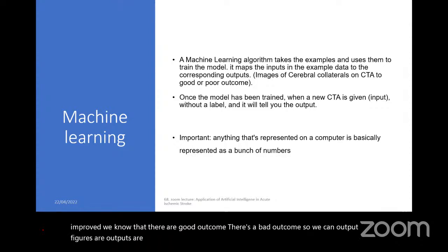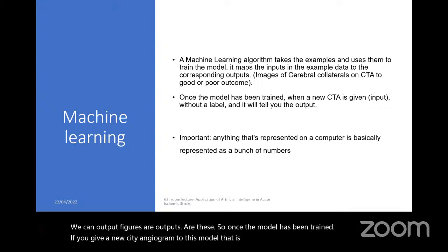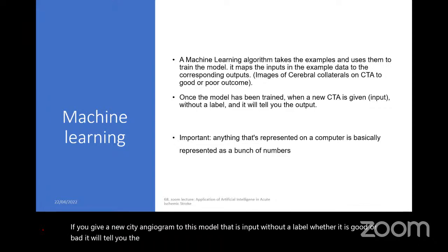Once the model has been trained, if you give a new CT angiogram to this model as input, without a label of whether it is good or bad, it will tell you the output, whether it is good or bad. So that is the importance.